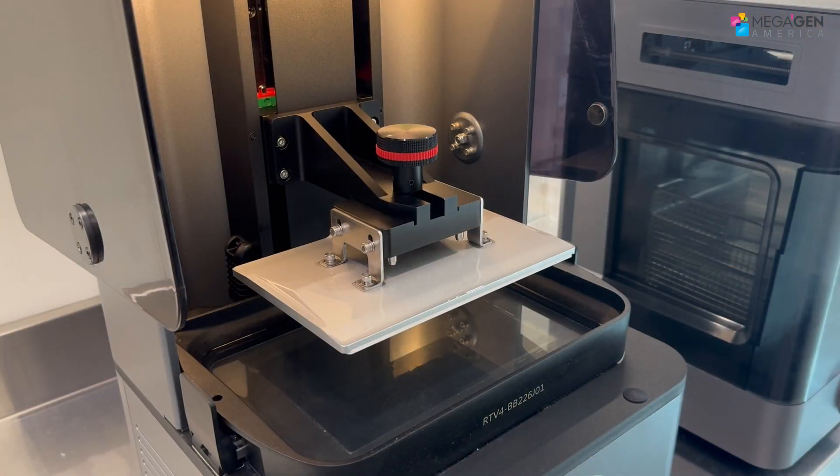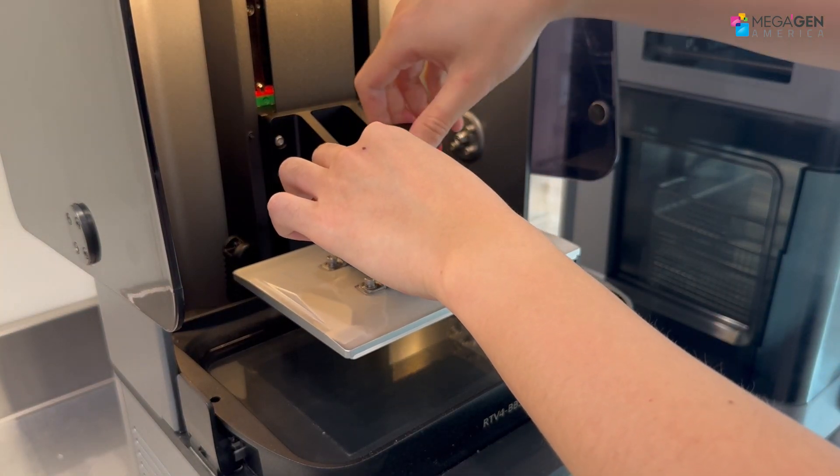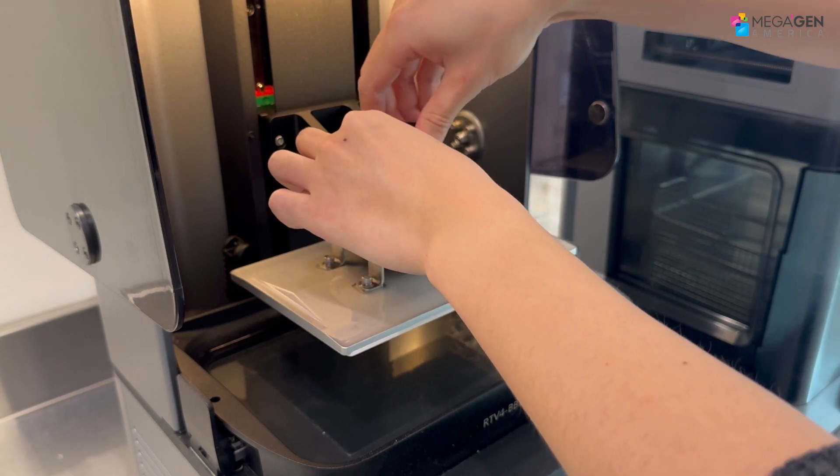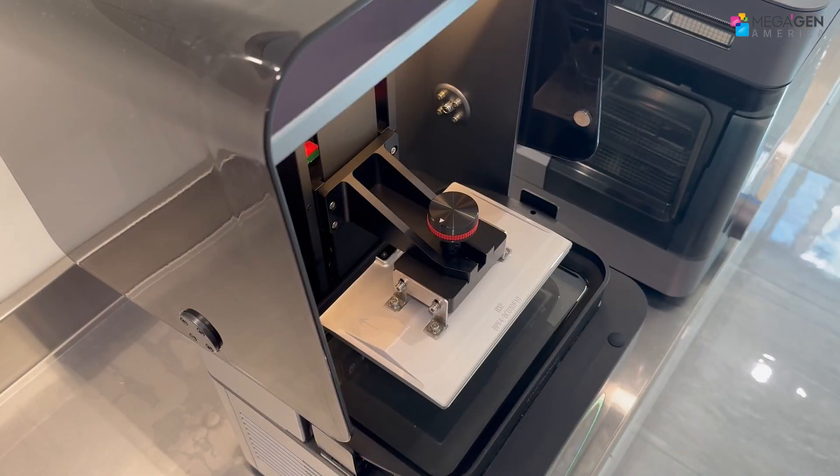Now that the guide is printed, carefully wipe the resin off the platform and transfer it to the washer. Do not allow resin to spill as it can damage the printer.